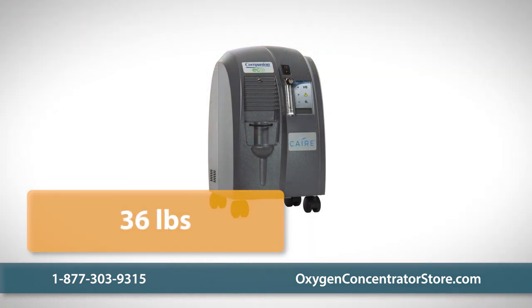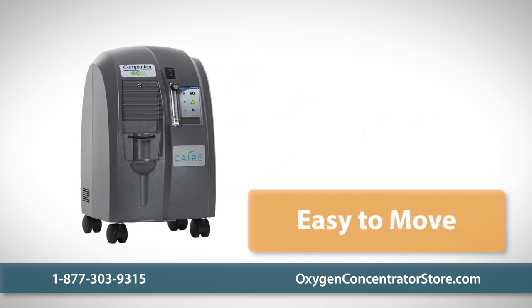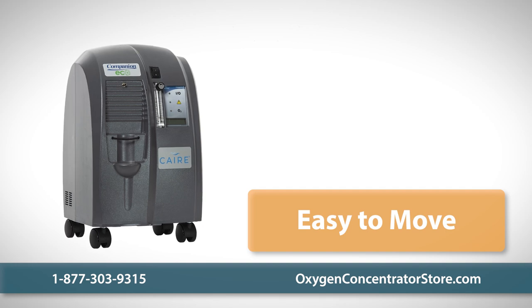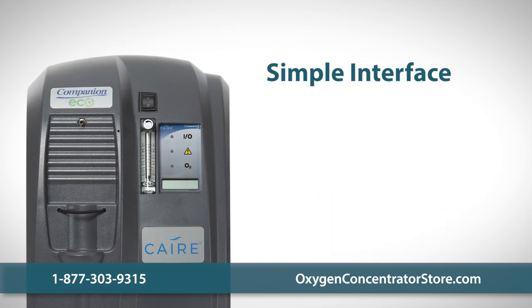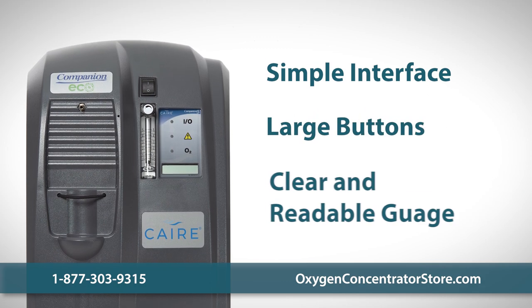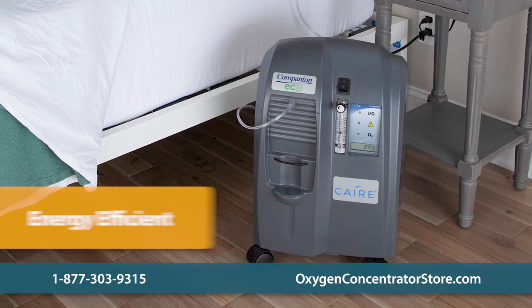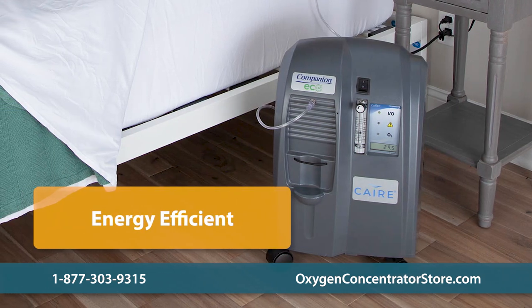The Companion 5 weighs 36 pounds and measures 21.5 inches tall, 12.5 inches wide, and 13.5 inches deep. Its design makes it easy to move and position by your bed or chair. The front control panel is easy to reach, features large buttons, and the oxygen gauge is clear and readable.